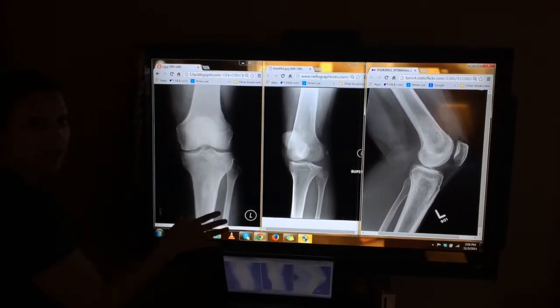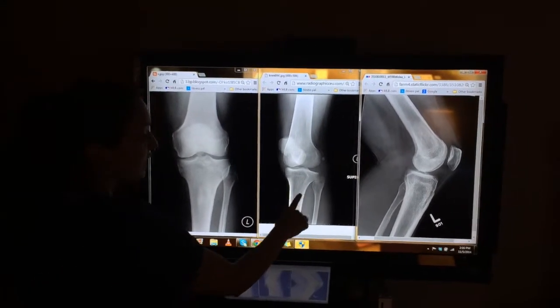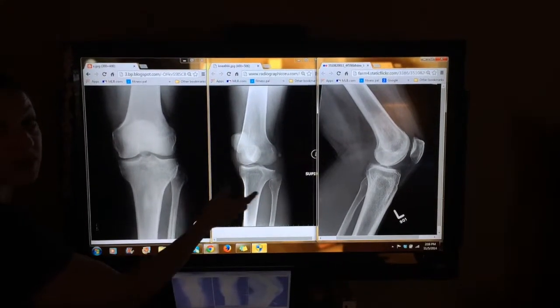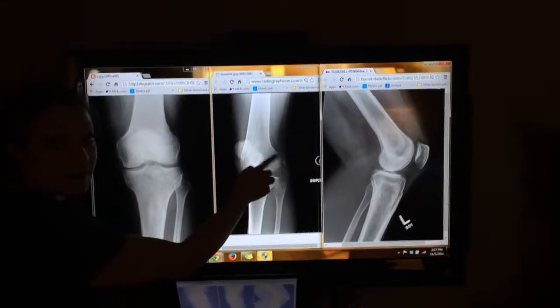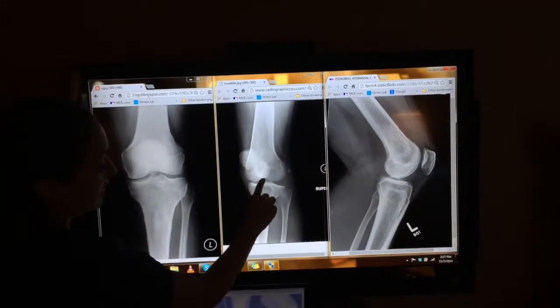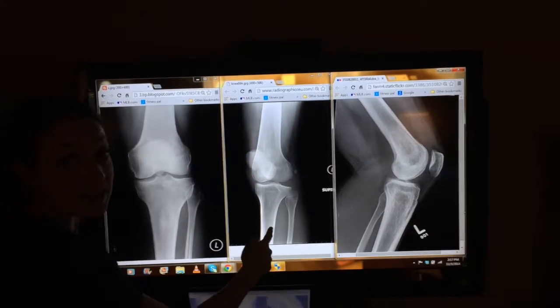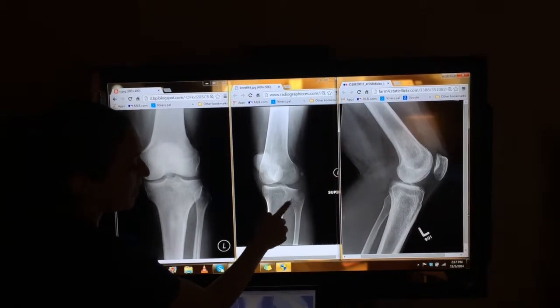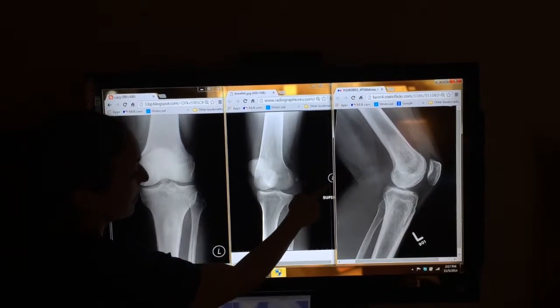The leg is completely extended, and I have my marker present. For this view, which was the medial oblique, you can tell that it's medial oblique because the patella has rotated to the medial side, showing enlarged magnification of the lateral condyle. There is great joint space with the rotation. The leg is again extended, and that medial rotation opens up the proximal fibular tibial joint, which looks great as well, and my marker is present.